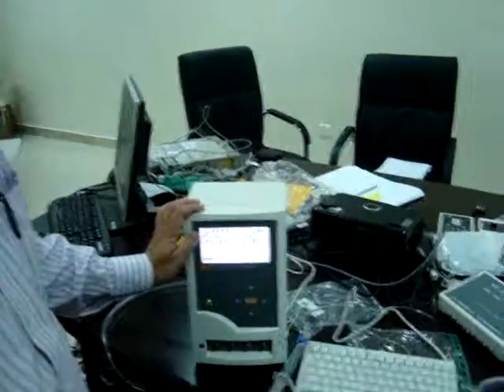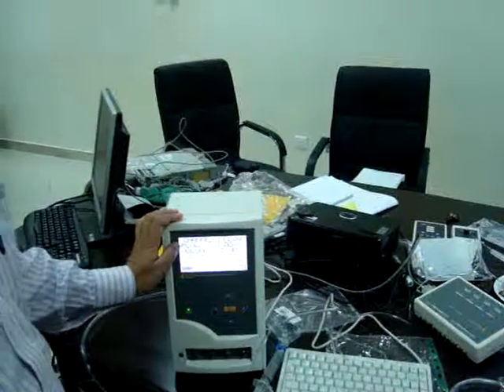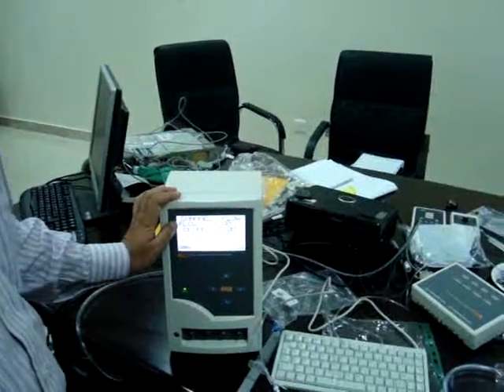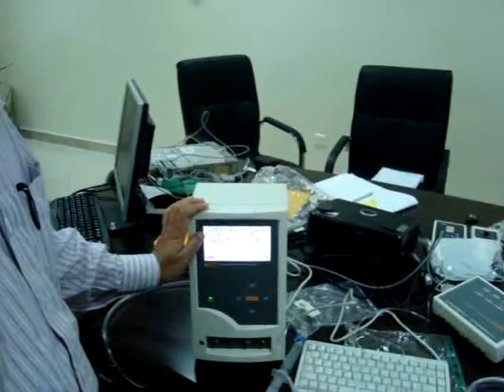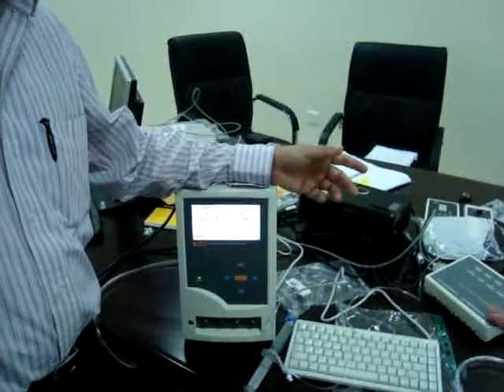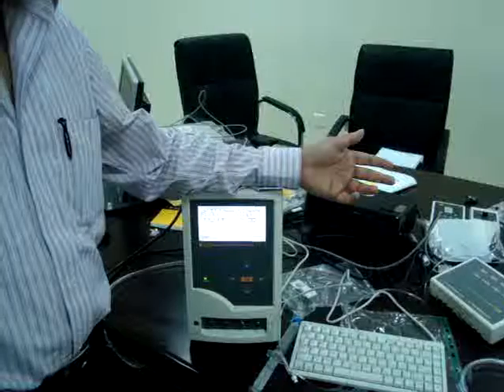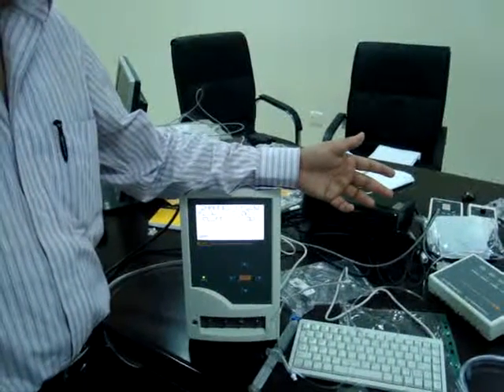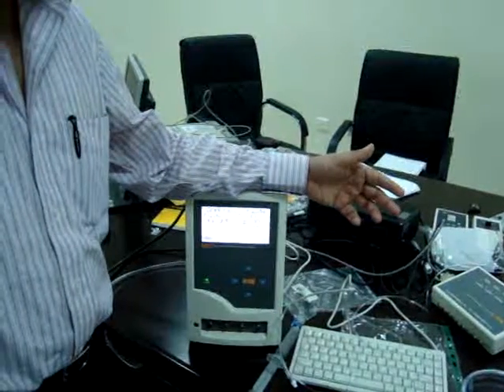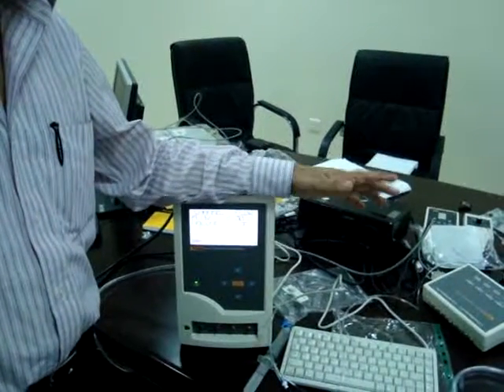When you are setting the device, that and this should match. What you are setting there, you set here also. The volume depends on how much you want to test, 50 ml or 100 ml. It's up to you. How much volume you test for, you can program it here.